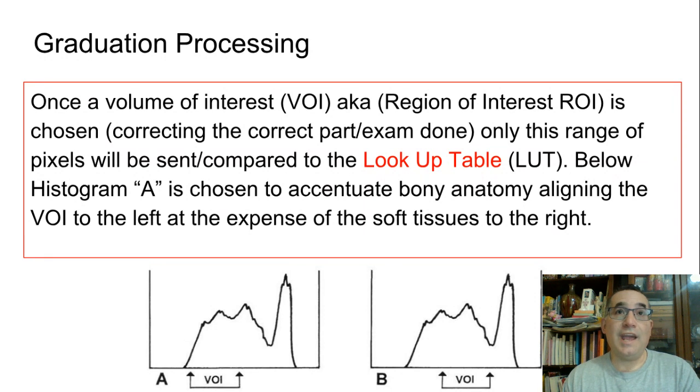So what has already happened, if you remember, is we've gone through a portion of the processing where spikes are removed, so raw radiation, for example, and barium, which might be a tail, is taken away and not going to be processed. And then we're left with several pixels, right? But we can essentially move our volume of interest.